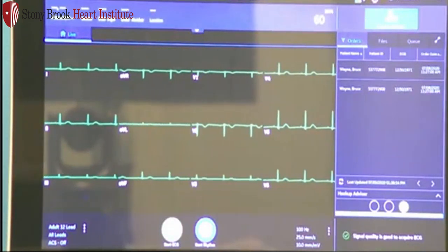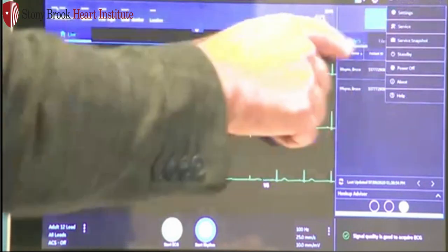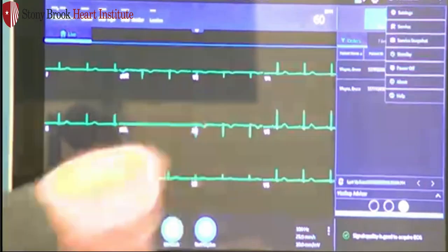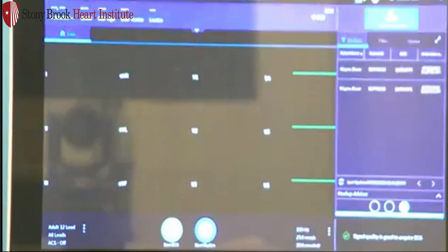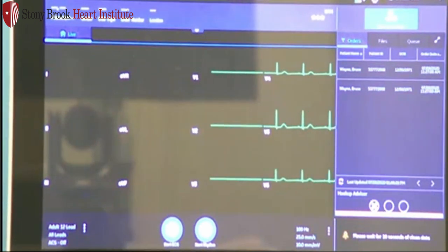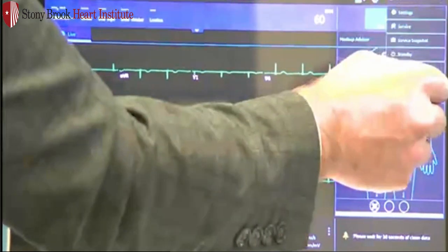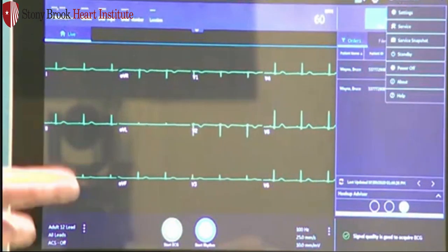To the right of that is the drop-down menu. If I tap the screen, that will display the drop-down. Within this, we have several settings: settings, service, a service snapshot, and one feature I like to show is the standby. If I press standby, it will black out my screen, covering patient information and saving battery life. To turn the cart back on, simply tap the screen. If you're not using the cart, I recommend plugging it in and hitting the standby button — you don't need to power it up or down after each ECG. Below that is a power button, so you can also turn off the device from the drop-down or just use the keyboard.